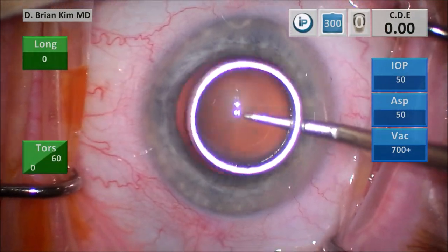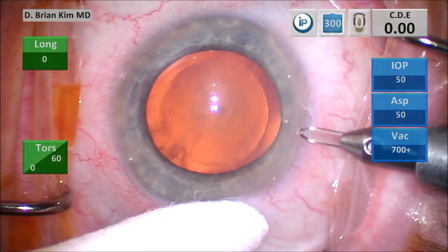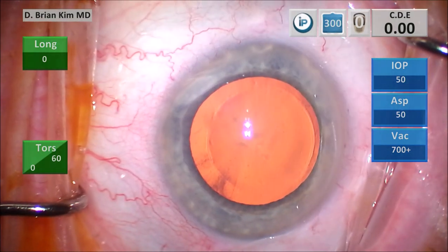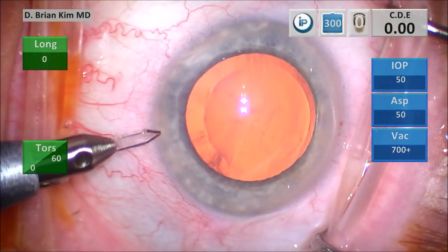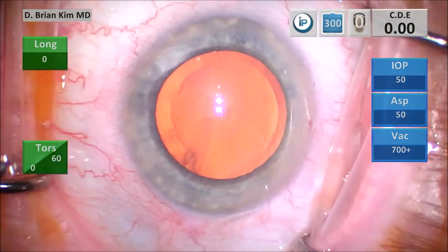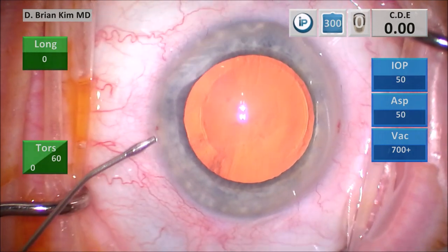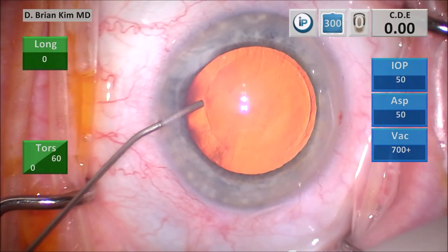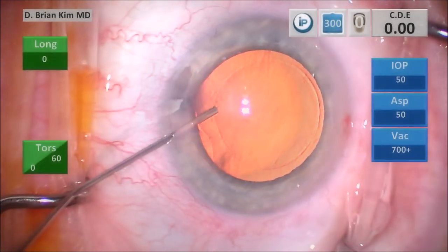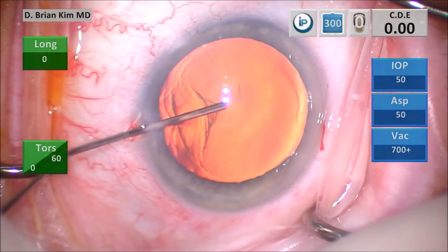I'm using a corneal marker to help me center and size my rhexis, and then I'm going to use a Q-tip to turn the eye. I'm going to make my paracentesis incisions inferiorly and superiorly. I want to make sure my paracentesis incision is parallel to the iris plane to give me a nice self-sealing corneal incision. I'm injecting some intracameral lidocaine, then injecting some intracameral dispersive viscoelastic. I use the cannula to hold the eye and I'm turning the eye.